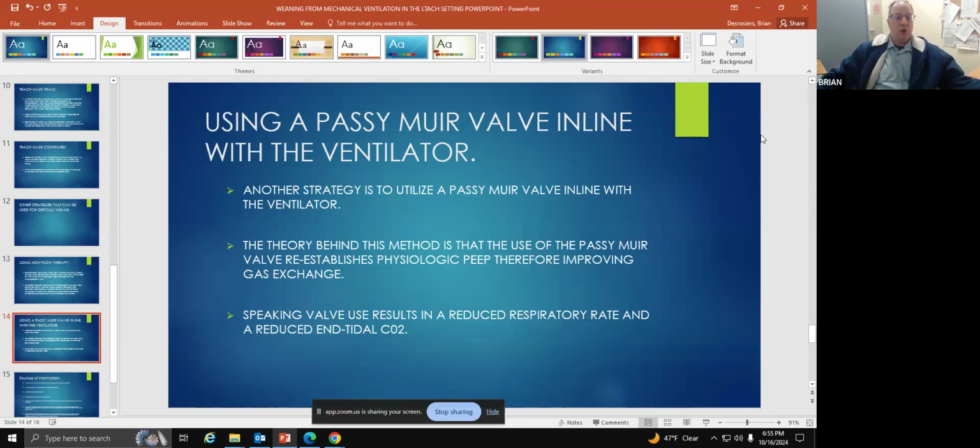You could have a patient who has a perfect blood ABG, perfect chemistries, a perfect SAT, but the patient's sitting in the bed and they're diaphragmatic breathing, they're working, their respiratory rate is starting to go up. So you kind of have to look at both things and put the puzzle together as to when the patient should go back on the ventilator.